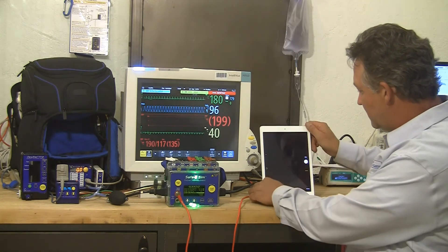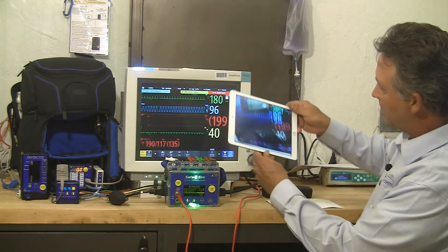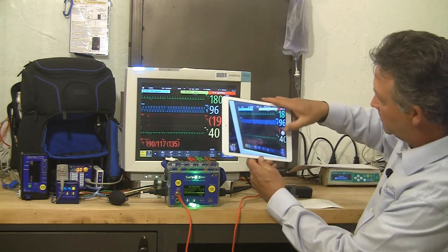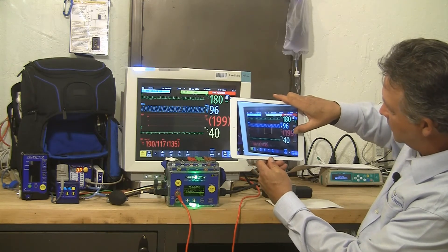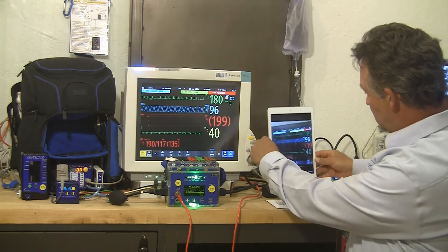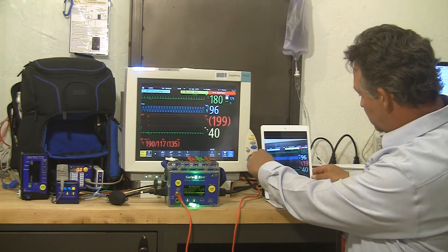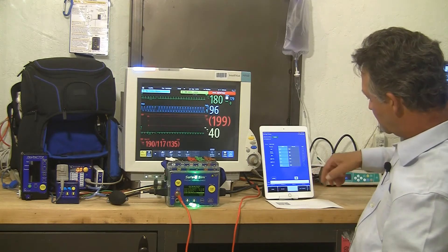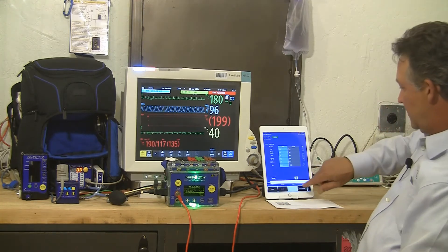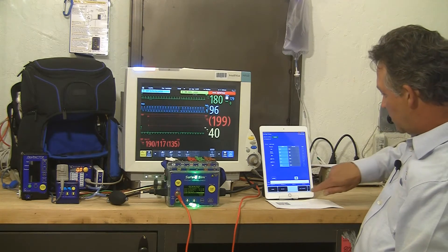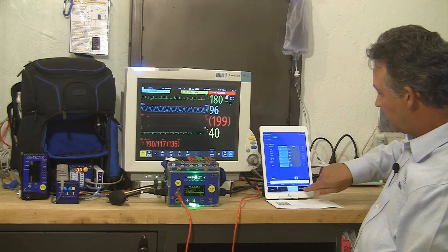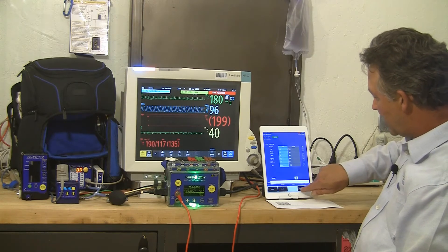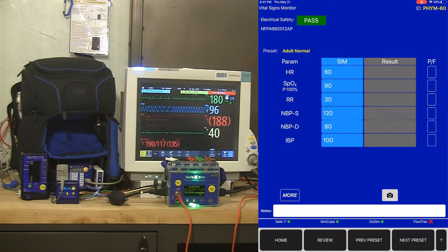If you want, from the app, you can actually take a picture of the Vital Signs monitor with those results in addition to or instead of typing in those results. There's a notes field at the bottom as well. I'm ready for my next preset. I'm done with my adult high simulated values. So now I'm moving to an adult normal preset screen.